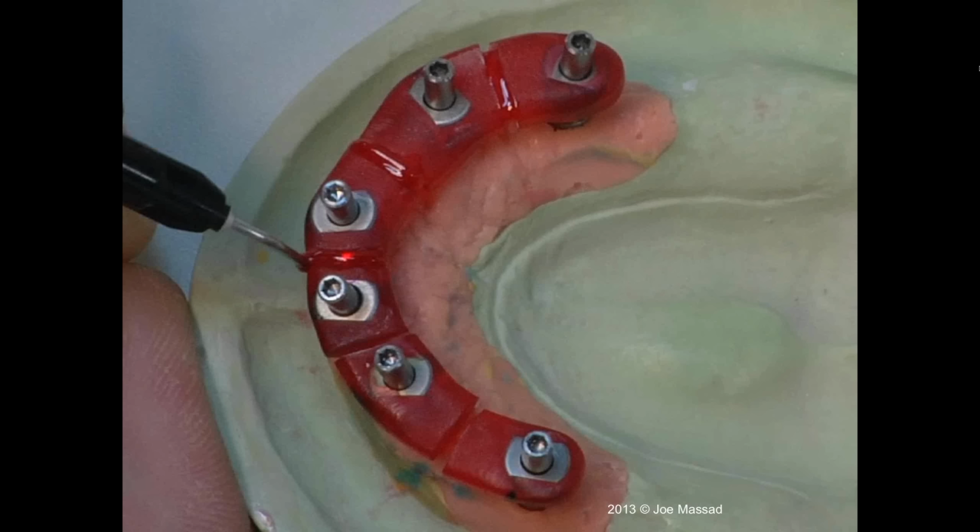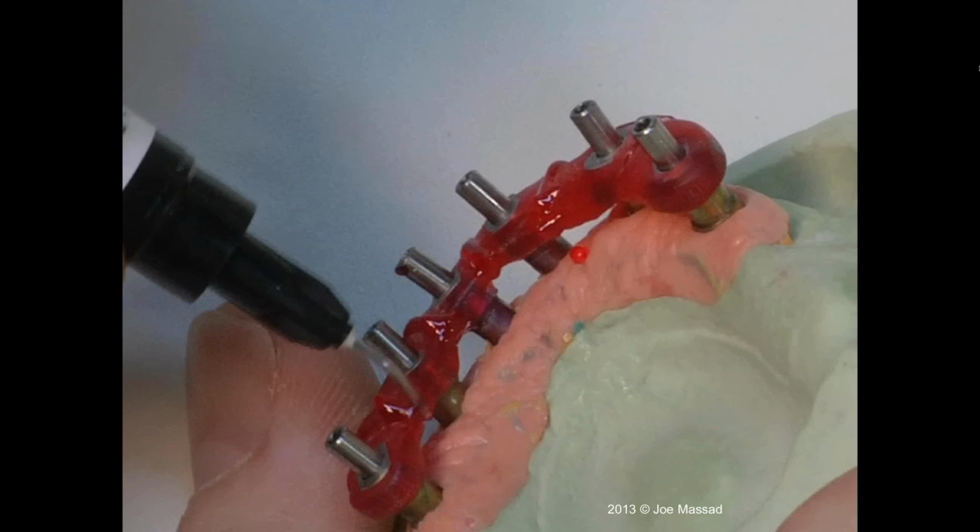Extremely brittle. It's only approved to be made outside the mouth, but you can put it in the mouth for your verification. You just can't put it in uncured. So this particular one, I want it brittle because if I get any tension at all, I'd like to see a crack in it, because I want to make sure that everything goes in passively.